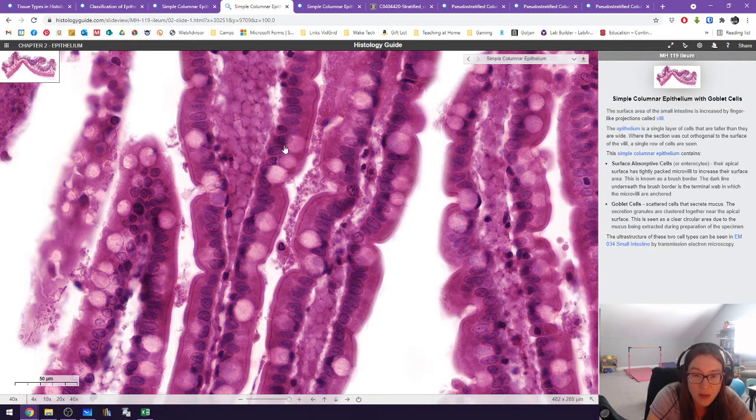Now we also have the ileum, which is part of your small intestine. This is another example of simple columnar epithelium, but it has a couple of other interesting things. This can be a little confusing because there are lots of folds in the intestines. This part here is the lumen. Here is one layer, but there's also a fold, so it goes up and comes down. Here's more. These are single layers of epithelium that are just folded on each other. It might look like you have two different layers, but this is a layer here and it folds, and then it's here and it folds, and here and it folds. So each of these is a single layer of epithelium.